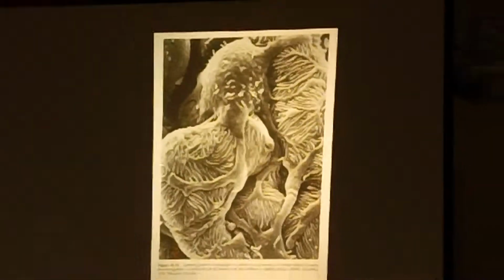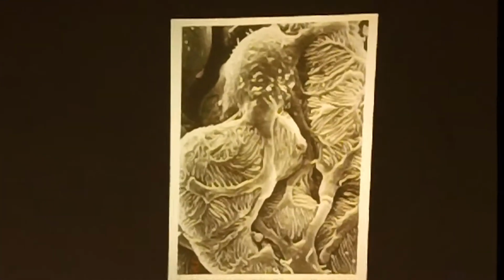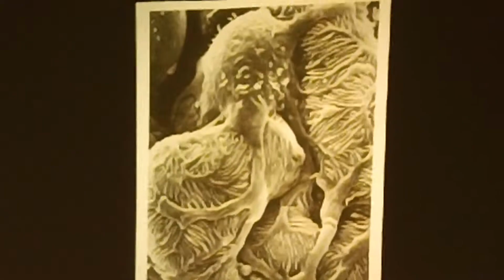Again, another image dear to my heart. Clearly looking at a filter here. How can you not love a podocyte? Well, look at this guy. All these nice processes, interdigitating.